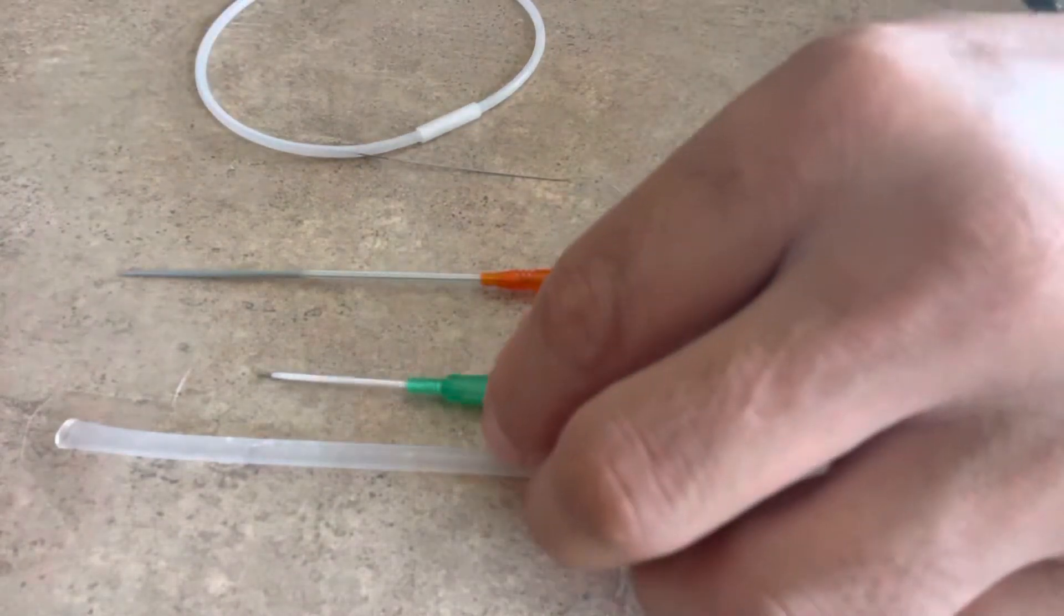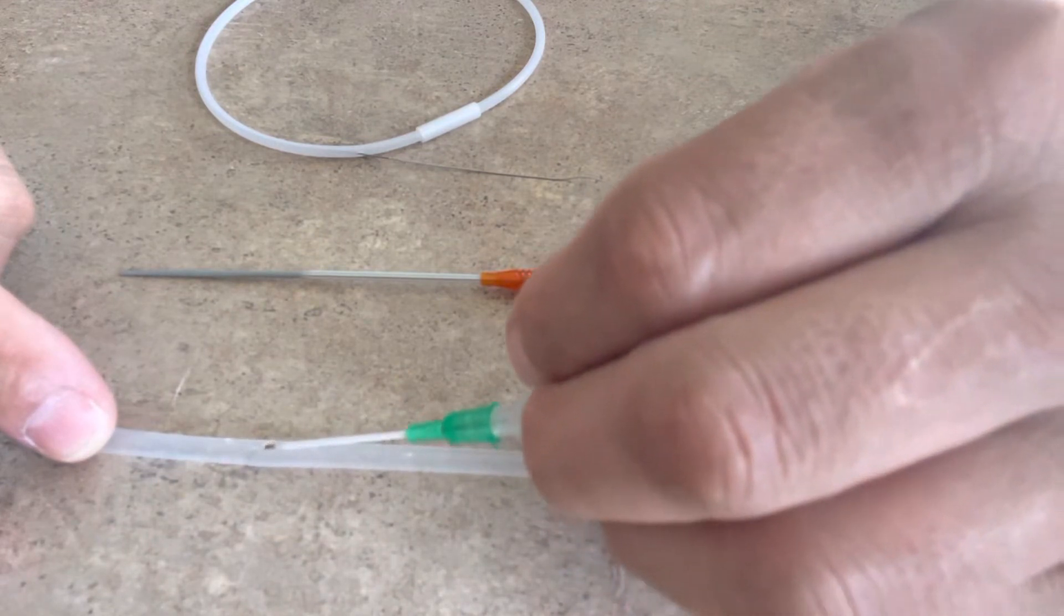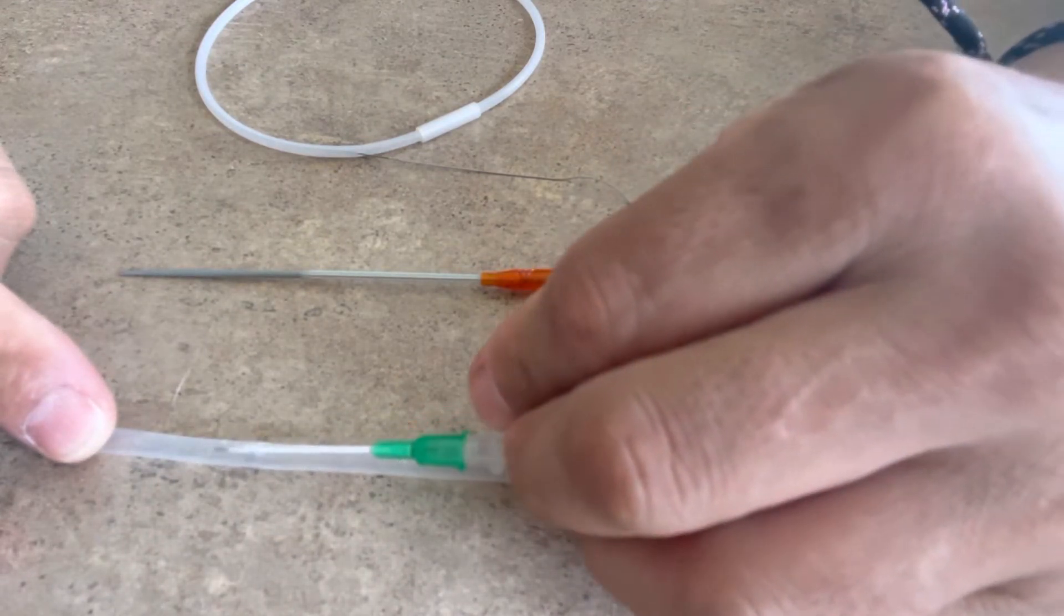So the first thing we'll do is we'll start IV access. So standard stuff, we're going to put in an 18 gauge angiocatheter here, like we normally would.